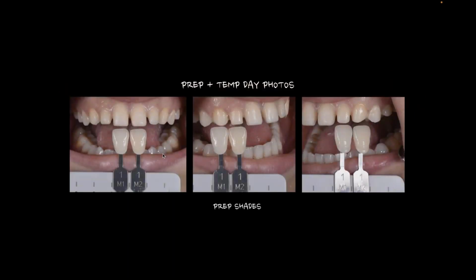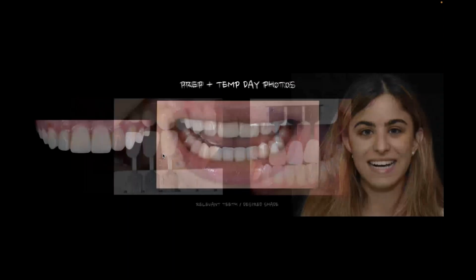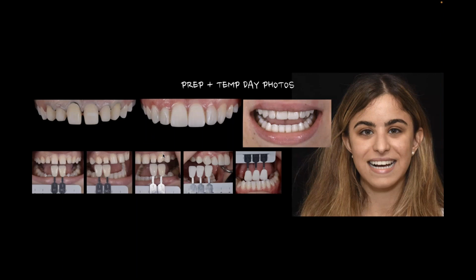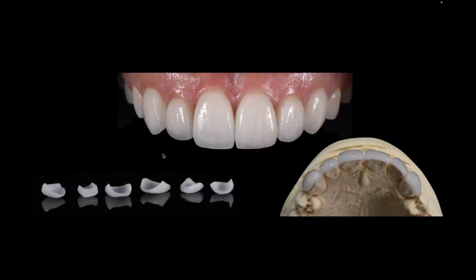Normal process, I won't spend time with this today: shade taking, communication of where we're going for the final, provisionalization for the patient, and then I'm going to come back and start working on the final veneers for this case. So in this case, we wound up doing 6 veneers on the patient. I'm going to try to create a little bit more translucency, a younger tooth. You'll notice I rounded my teeth a little bit more in the final than they were for the original wax-up. I kind of caught that as we were looking through the case.